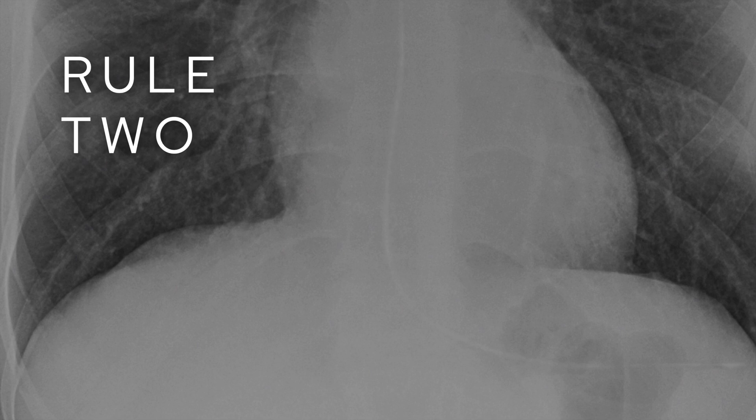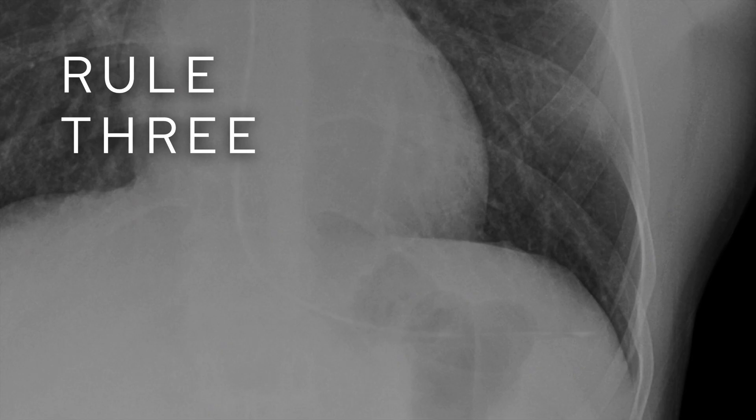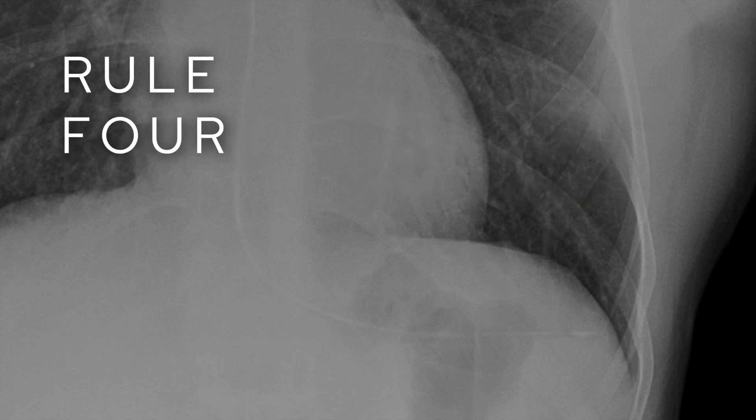The story doesn't end there though. Follow it down and have a look at the level of the diaphragm — does the tube pass within the center, within the middle? If it does, again you're more likely that the tube is going down the esophagus and through the gastroesophageal junction. Then it should go to the stomach in the left upper quadrant of the abdomen. The next step is to make sure the tube passes below the left hemidiaphragm.